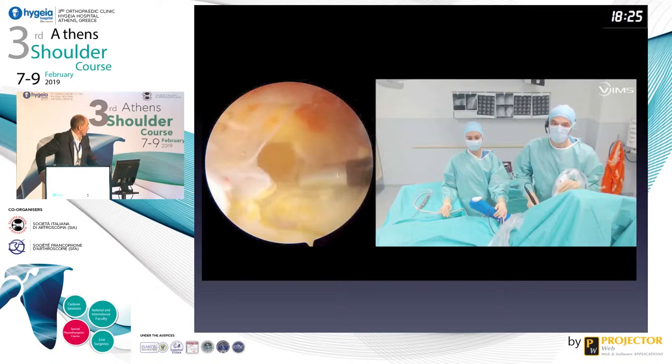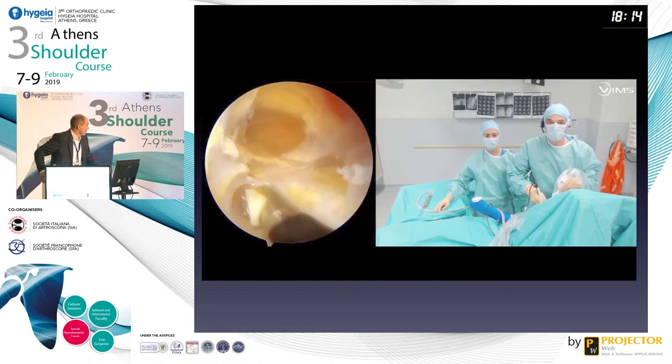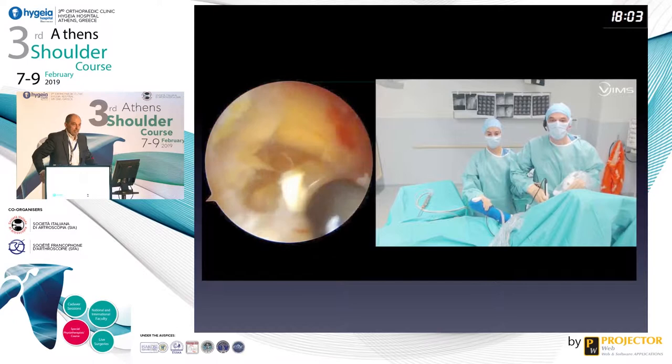So now you have to prepare this space. And in fact, you are not going from lateral to medial. You are going from anterior to posterior. And this is very, very important to understand. I am here at the upper part of the lat dorsi. On the left, you will see the subscap and the three sisters. And it's a little hazardous there because you have the axillary vessels with the axillary nerve.